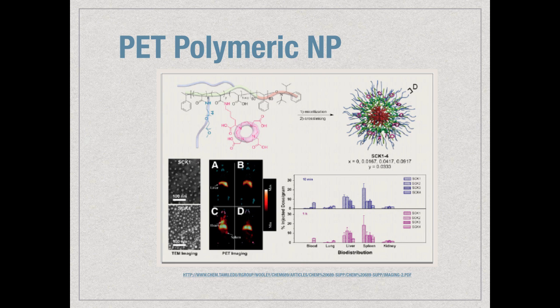And if you know how much drug was loaded into these nanoparticles, then you would be able to calculate how much drug actually reached the tissue, as opposed to just guessing based on the blood profile and the pharmacokinetic mathematical algorithms that we've talked about.